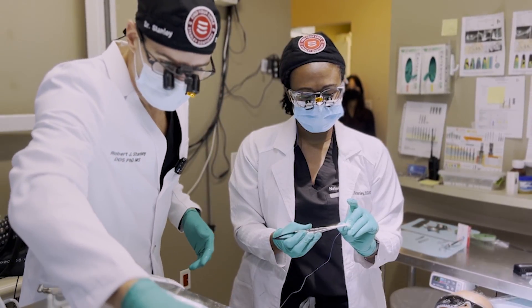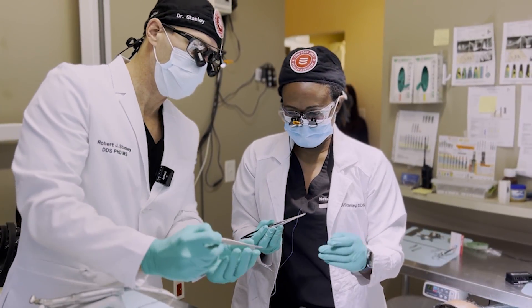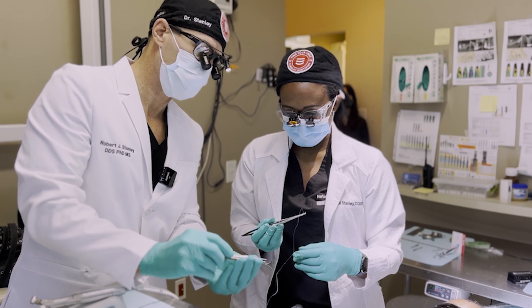Just do a couple simple interrupted sutures right between the implants, and then that's it. My favorite pickup for this is the two-in-ones, because it can actually hold the tissue a little bit.